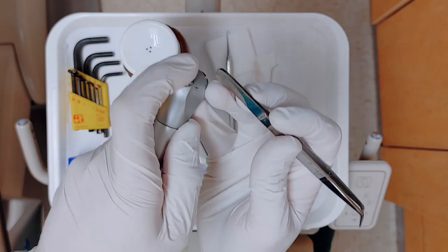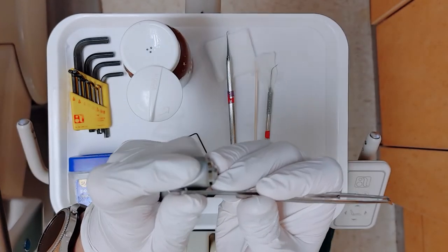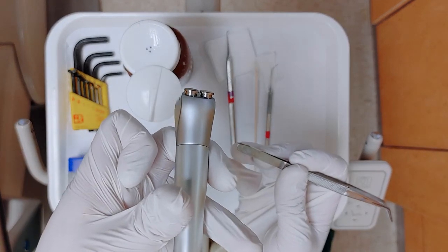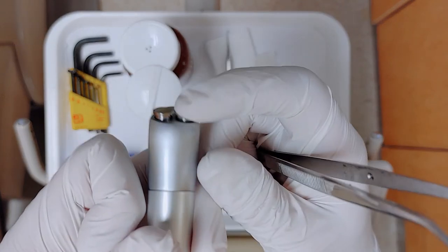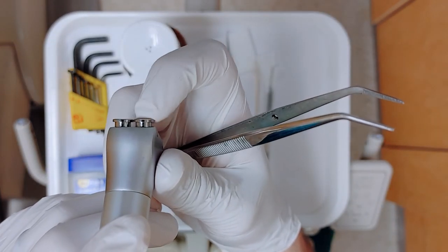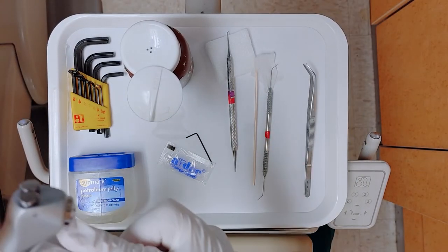make it flush. If you notice right now, I still have a little piece that sticks out here off on the side, so I might need to put a little extra pressure to make sure that that's nice and flat. Now I can let go, check out my buttons, make sure that my buttons spring up completely. Looks like they both match each other. Pretty good. I can put that off to the side. And that's how to go about repairing one of these air water syringes that have sticky buttons, at least for the one that has a collar on it.